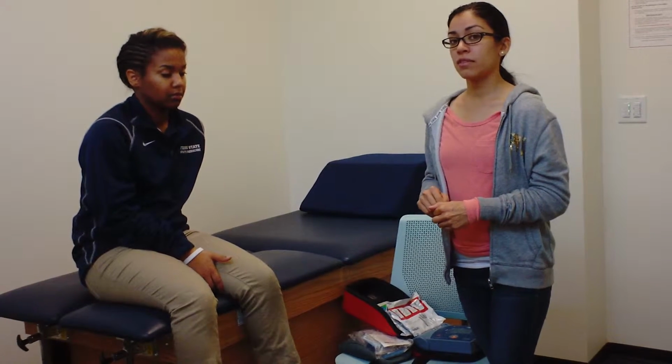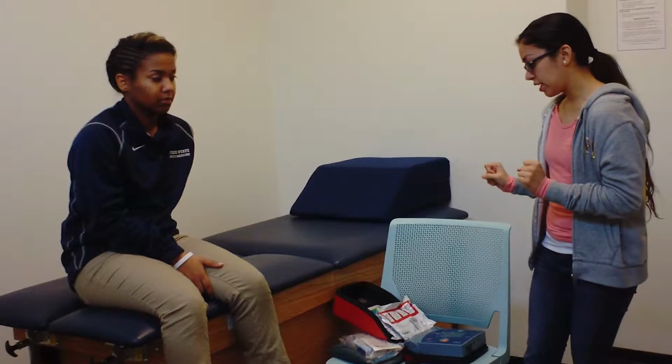I'm going to proceed with CPR. I'm going to do 5 cycles of it, which is approximately 2 minutes. As soon as I've done 2 minutes of CPR and the AED has been brought to me, I'm going to stop CPR and start using the AED.